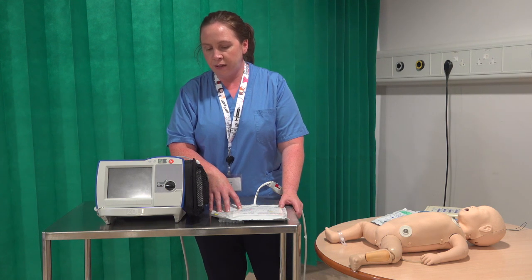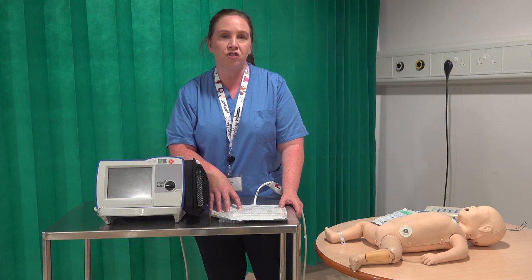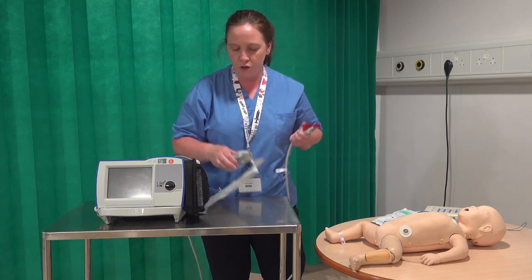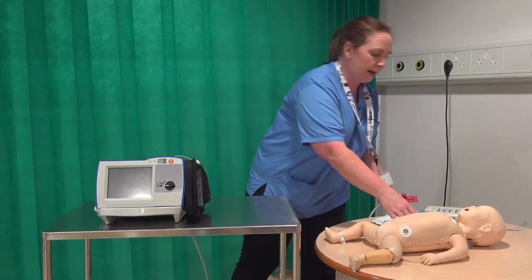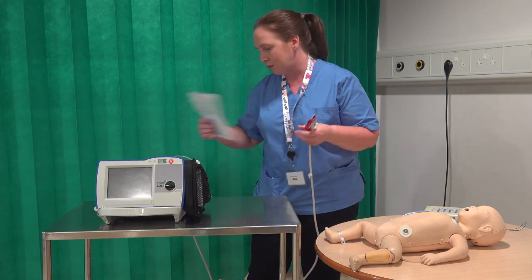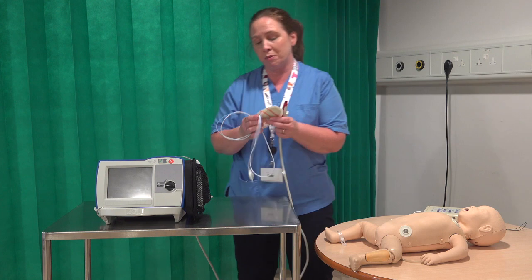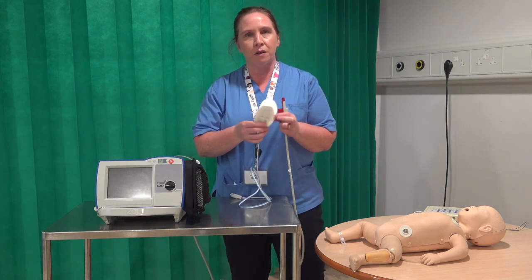If you do need to bring this machine to the patient's bedside in NICU, one of the first things you need to do is change your adult pads. You're going to take your pads apart just as you normally would and get your neonatal pads. Your neonatal pads come in a pack like this — it should be sealed, so you're opening a fresh set of pads for each cardiac arrest or cardioversion.